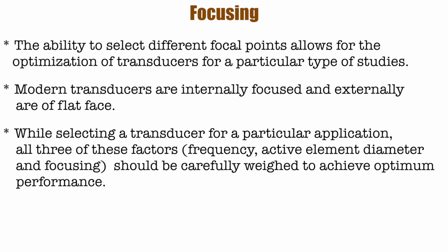While selecting a transducer for a particular application, all three of these factors, frequency, active element diameter and focusing, should be carefully weighed to achieve optimum performance.